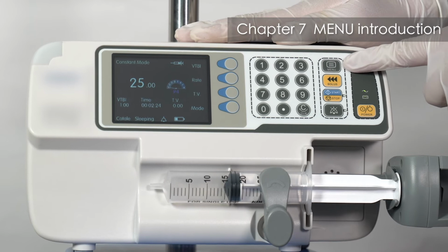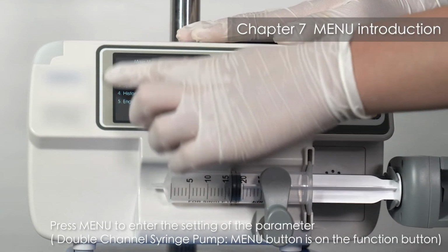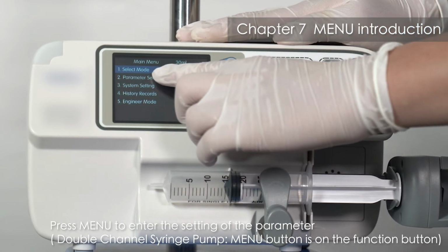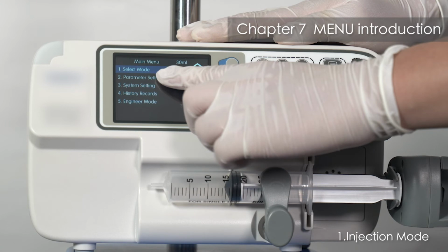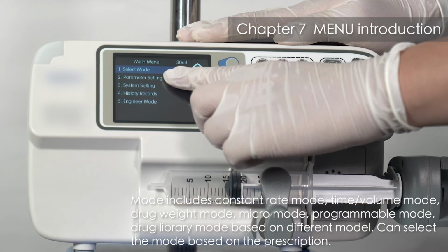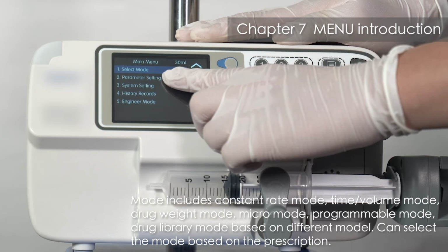Chapter 7. Menu Introduction. Press menu to enter the setting of the parameter. Double channel syringe pump. Menu button is on the function button. 1. Injection mode. Mode includes constant rate mode, time, volume mode, drug weight mode, micro mode, programmable mode, drug library mode based on different model. Can select the mode based on the prescription.